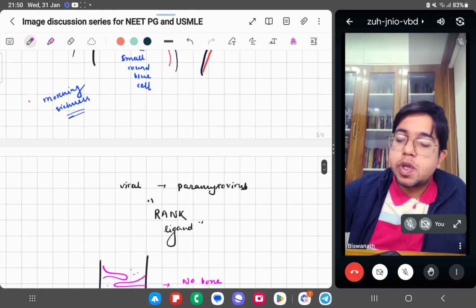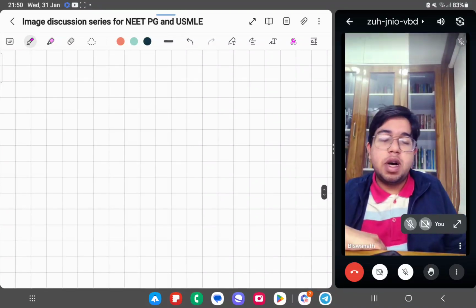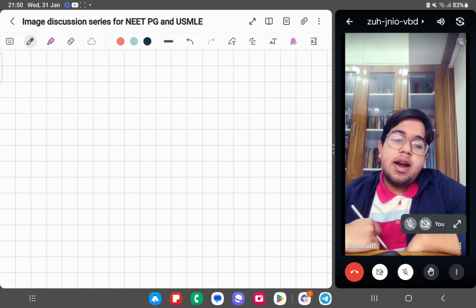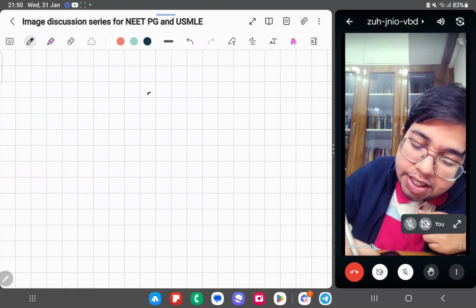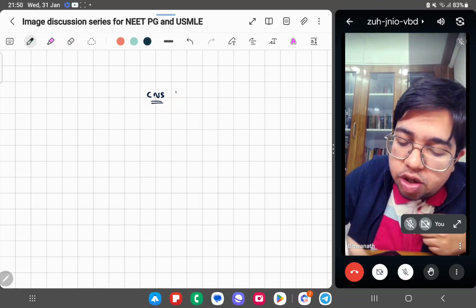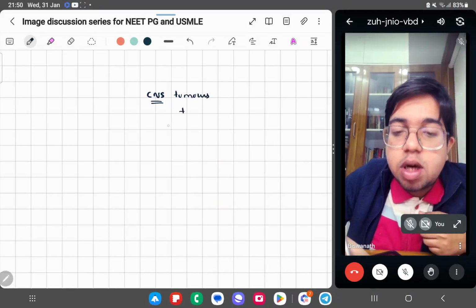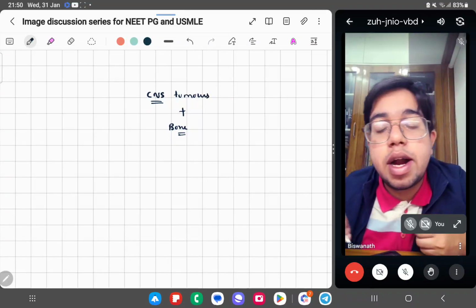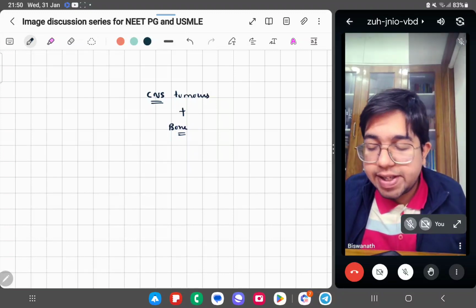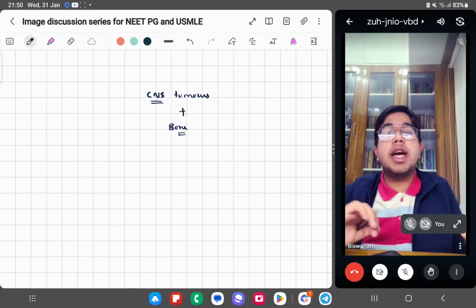With this, we come to the end of part one of the image discussion series. Today I discussed some CNS tumors and some tumors of the bone, about rheumatoid arthritis, osteosarcoma, and Ewing sarcoma. Ewing's I probably didn't discuss. So with this, we come to the end.